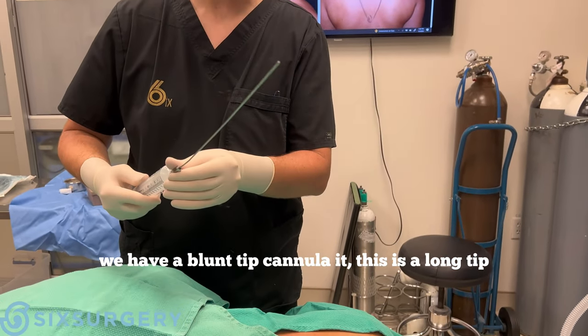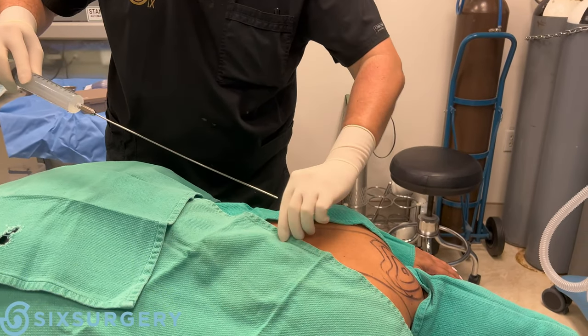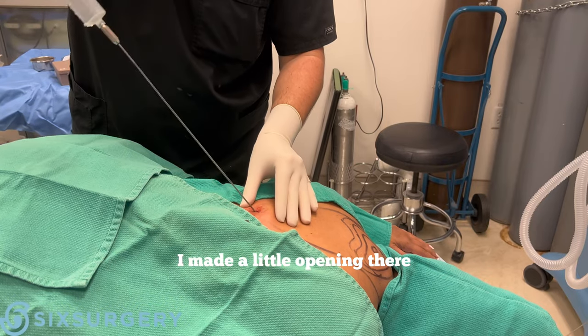Next I'm going to inject some more freezing with a blunt tip. This is a long tip so I can go from here all the way there, through a little opening there.